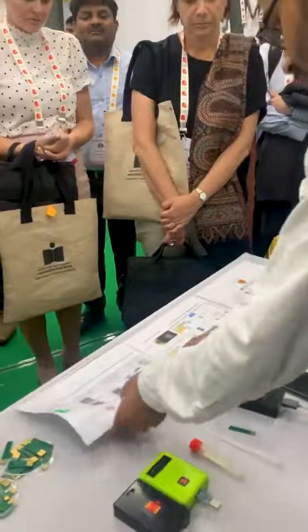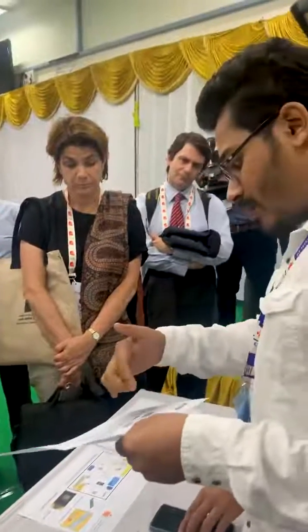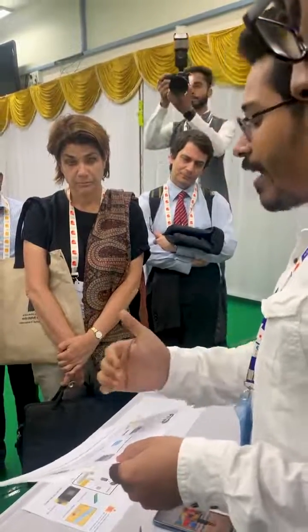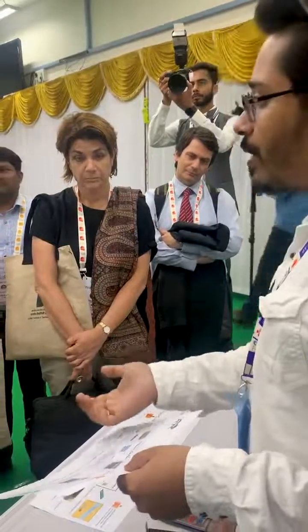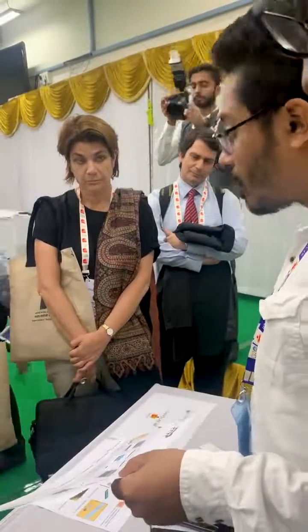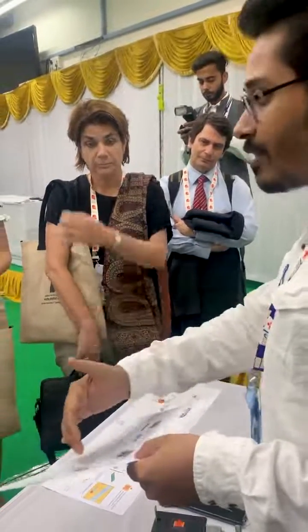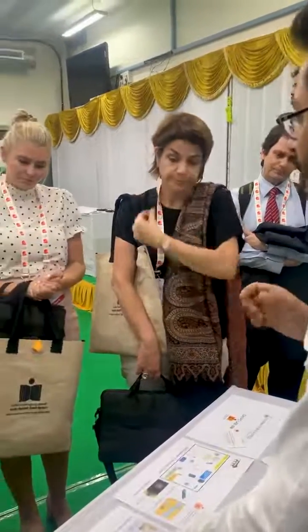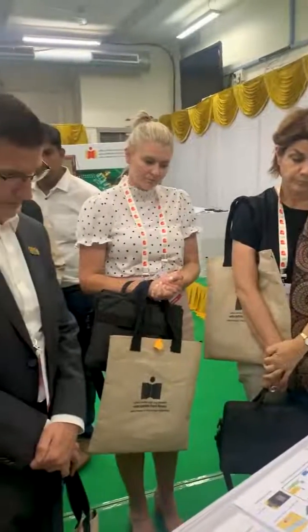So here, for the sensor testing, we need an Android application, and that application can be installed on the mobile. And these are the patient registration steps, so that for each patient one unique ID gets created, and with that ID we can test the device.